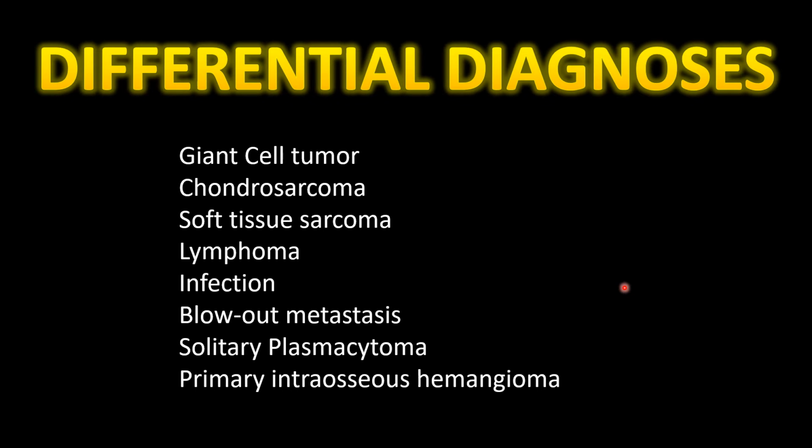So if we go back to our list of differential diagnoses and think about all the information we've seen so far, being the clinical, x-ray, and MRI findings, this case ended up being a solitary plasmacytoma, and this was proven on biopsy.